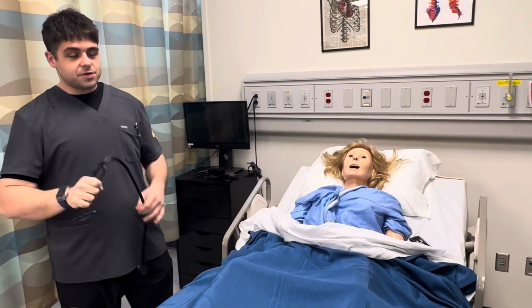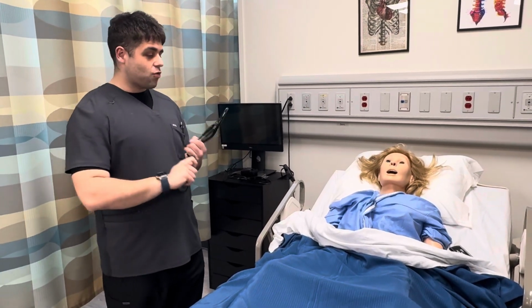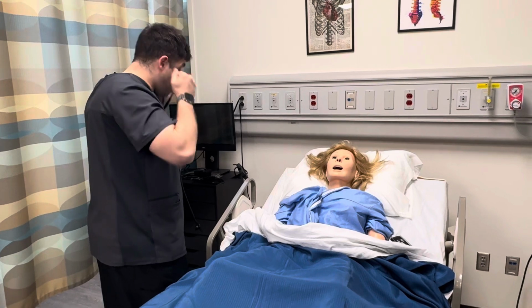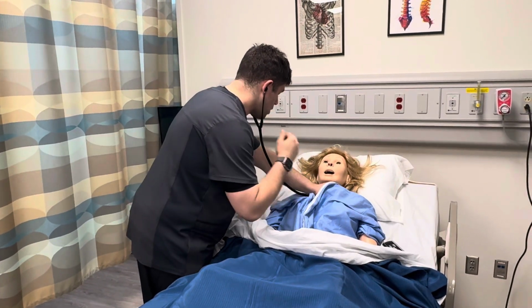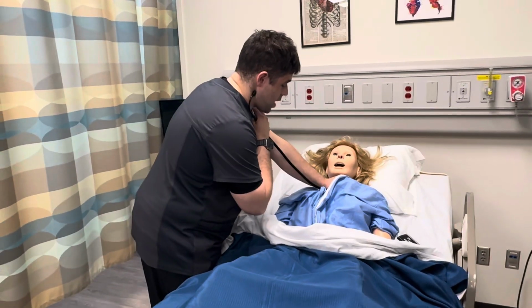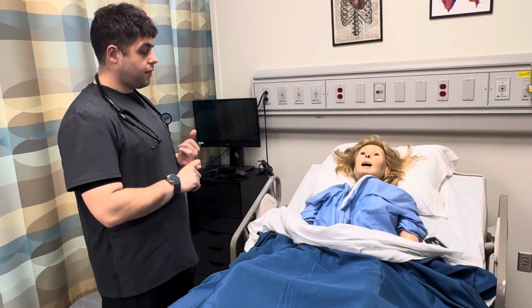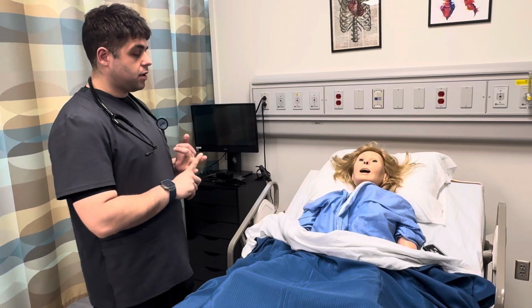In the beginning of this assessment, I would have gotten a baseline set of vitals, which were all normal and in range, and I got her height and weight at the beginning of this video. I am now going to auscultate her apical pulse. Auscultation of the apical pulse takes a minute in practice. Apical pulse is normal. I'm going to then ask her subjective questions, if she's had any cardiovascular issues in the past, if she exercises.